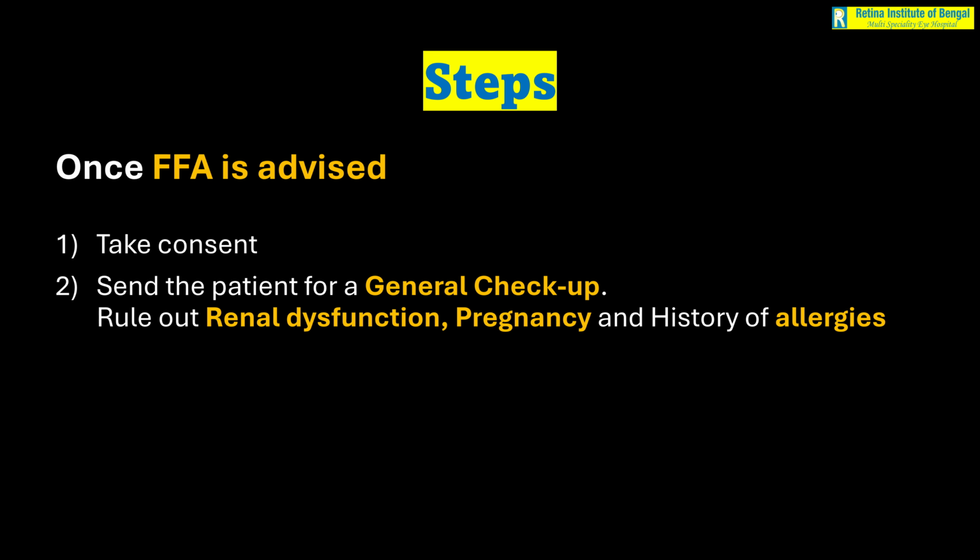The second thing, of course, we have to rule out is pregnancy, which is an absolute contraindication for fundus fluorescein angiography. And third is, we need to look for history of allergies, because people who have history of allergies might react to the dye itself, because reactions or sensitivity to the dye is reported, and allergic reactions to this dye can vary from mild itching to severe anaphylactic shock.